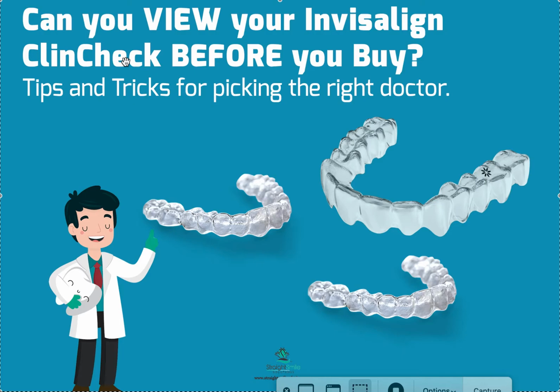So my suggestion is not to put down any money before you see the ClinCheck, if that's a concern to you. I really don't know any doctors that would not be okay with that. Everyone I know would be fine with that if you ask. Of course, they would like to get you committed to treatment sooner, and they are using a little time and resources, but if they have an intraoral scanner, it literally takes them 1 minute to scan you.